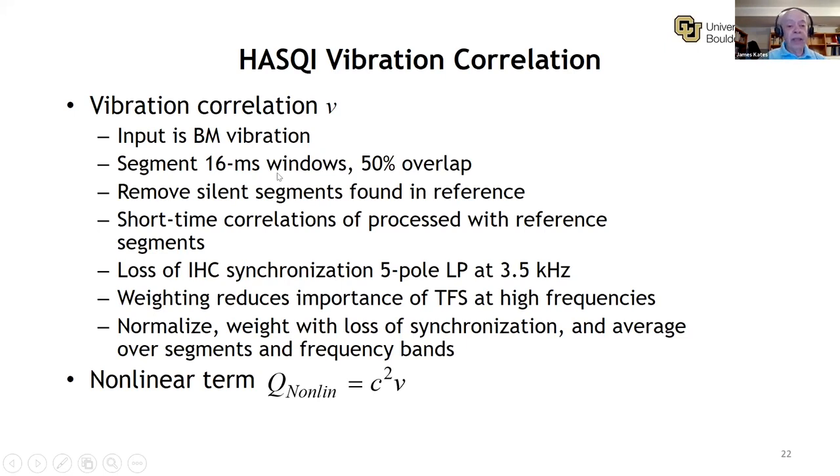Again, you're looking at 16 millisecond segments. And what we're going to do is cross-correlate each segment in the hearing aid output with the corresponding segment in the clean reference signal at the hearing aid input if we're just looking at hearing aid processing alone, no noise.